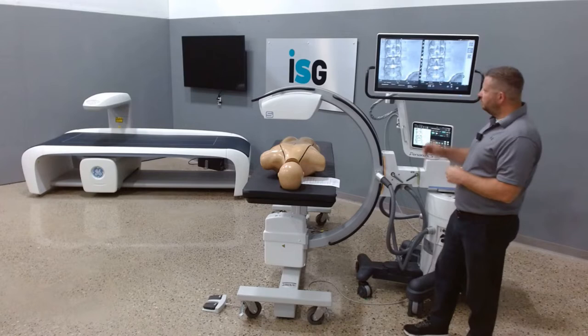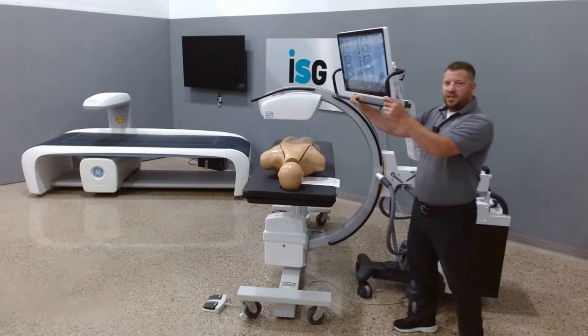Fully customizable location for the C-Arm monitor itself, it can be viewed on either side of the C-Rotation.